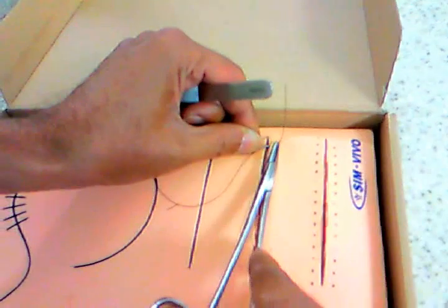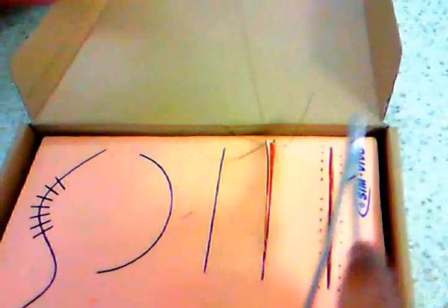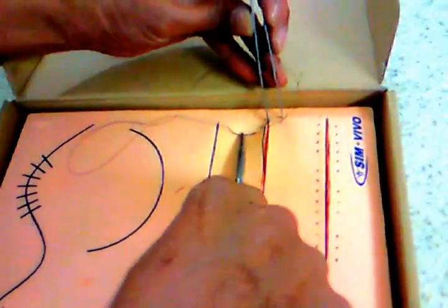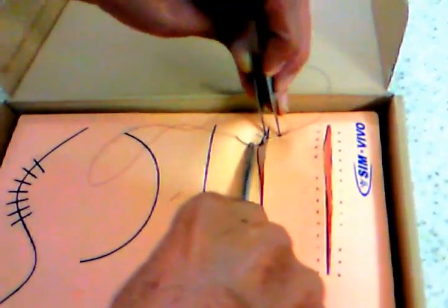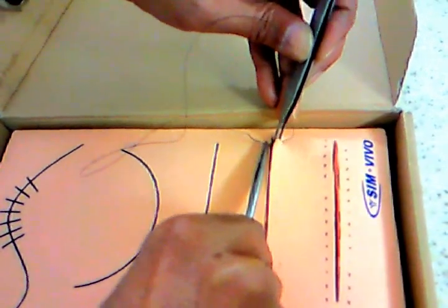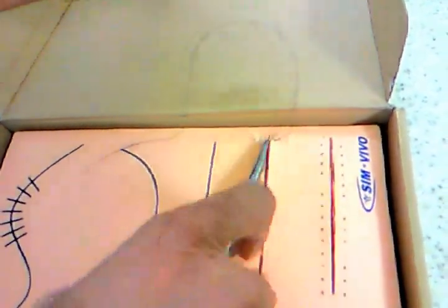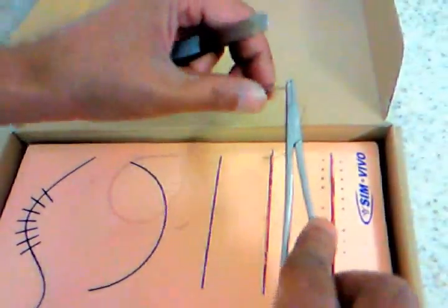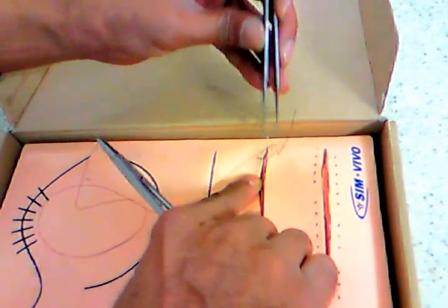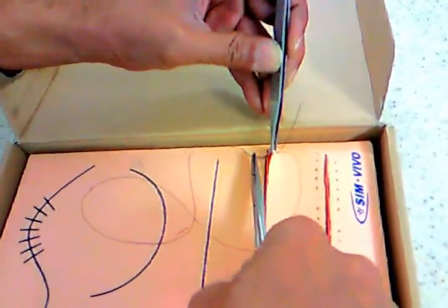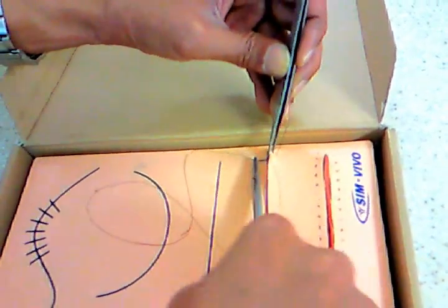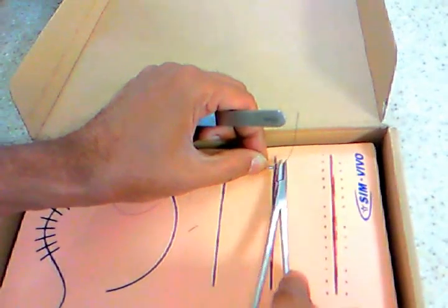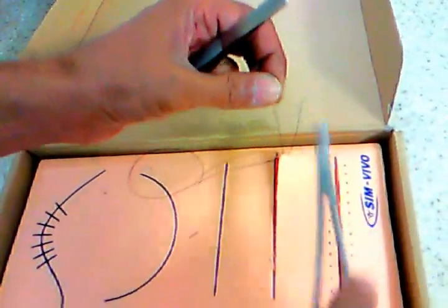You see it cut through. So I have to take it again. It's repeatedly cutting through. It actually happens also. In actual situations, it keeps cutting through because it's a very delicate one at the dermo-epidermal junction.